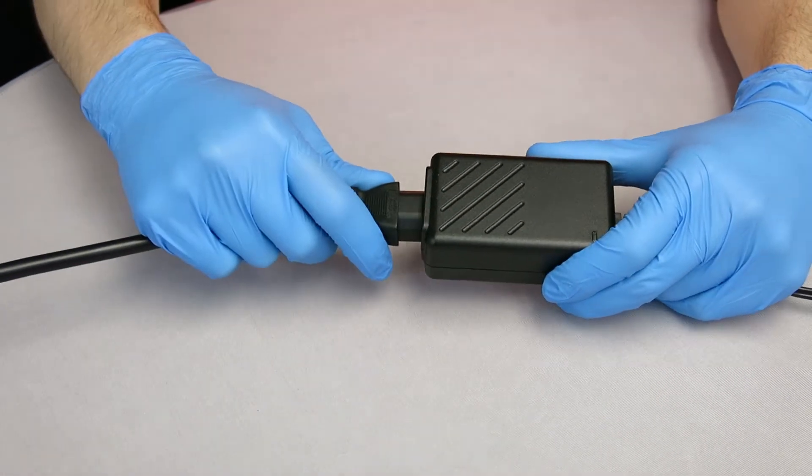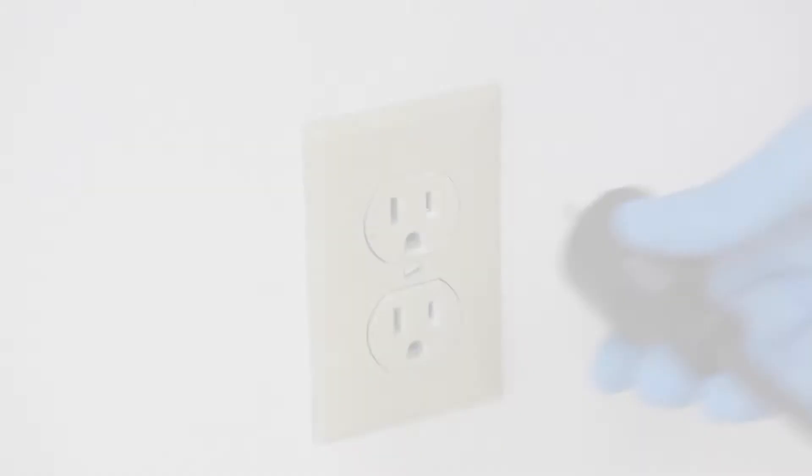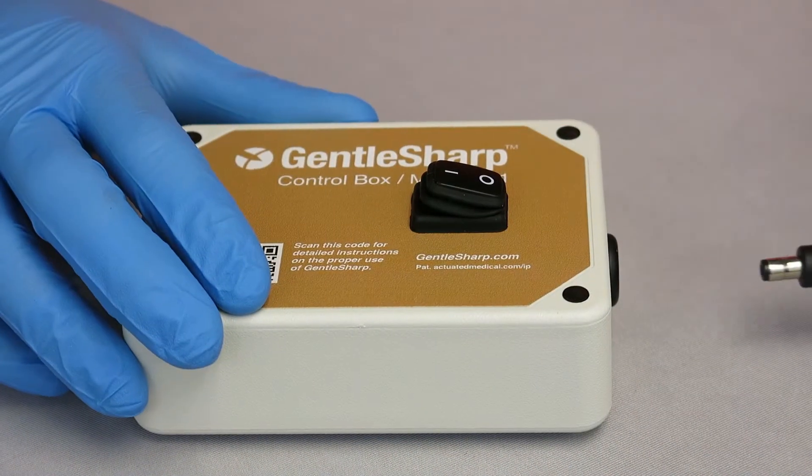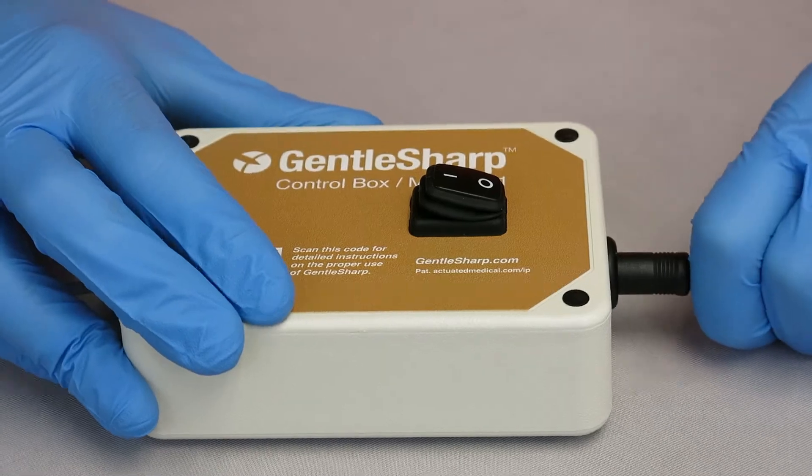Verify that the power cord is securely plugged into the power supply. Plug the power cord into a standard wall outlet. Plug the power supply into the jack on the control box.